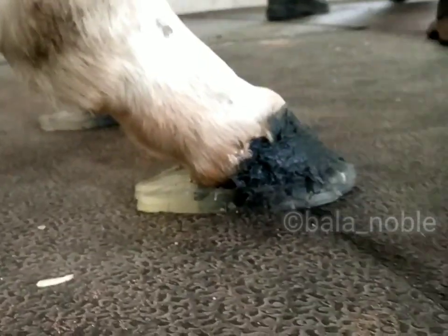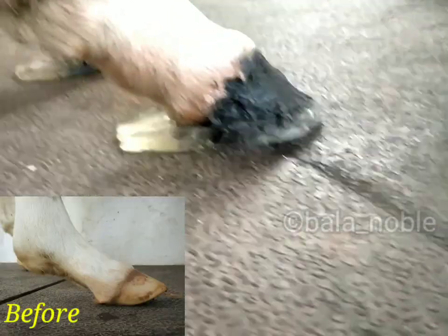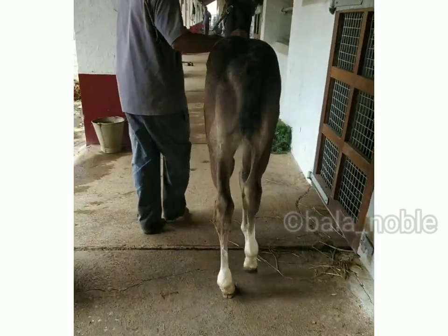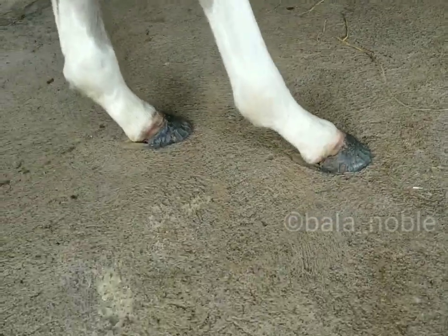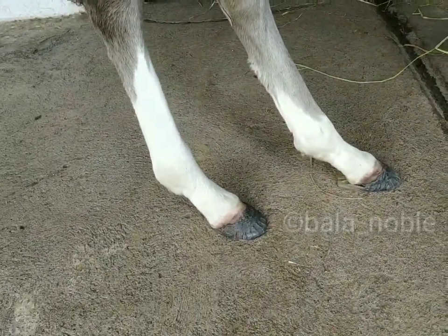Finally the shoe is fixed. This is after 3 weeks — almost normal now — and now we can remove the shoes.